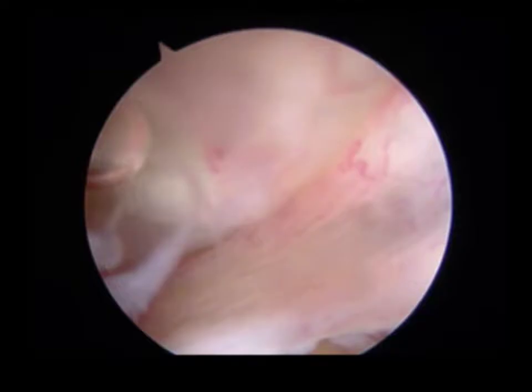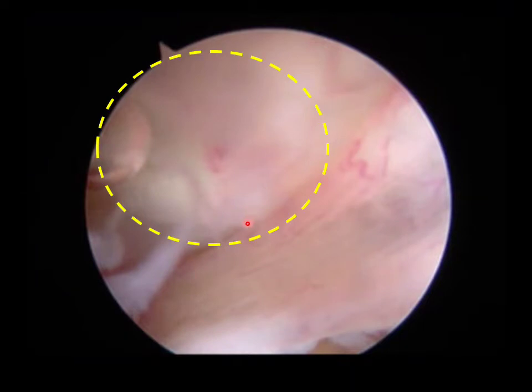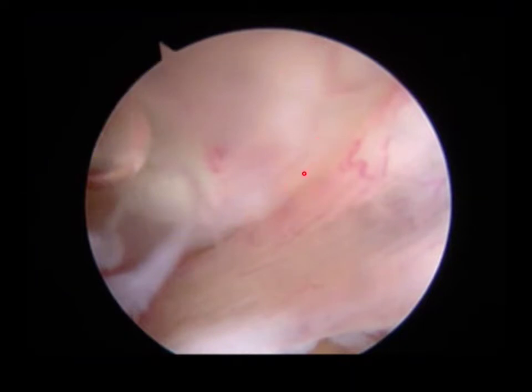These are the bursoscopic findings. The arthroscope is inserted into the deep infrapatellar bursa through the lateral portal with the knee in extension. This area is suspected to contain the ossicle; however, the ossicle cannot be clearly identified.